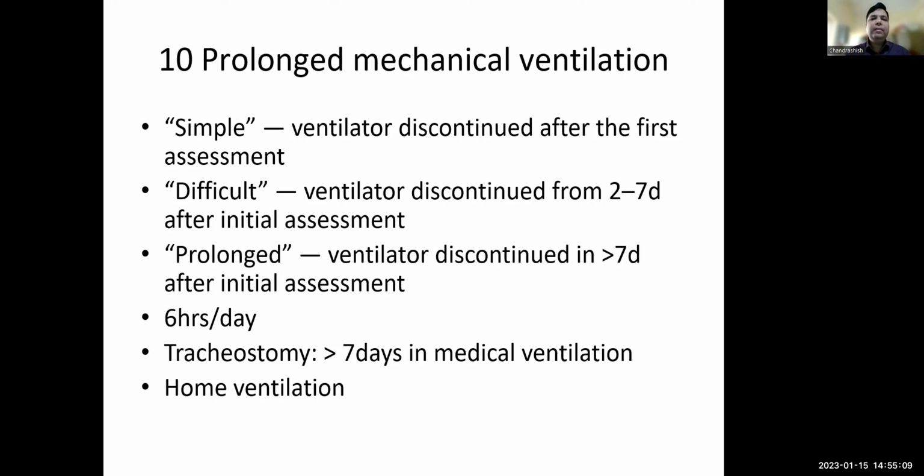Lastly, mechanical ventilation. There's a new definition where they say that weaning can be divided into simple, difficult, and prolonged. Simple are those where the ventilator is discontinued after the first assessment. Difficult, ventilator discontinued from 2 to 7 days after the initial assessment.